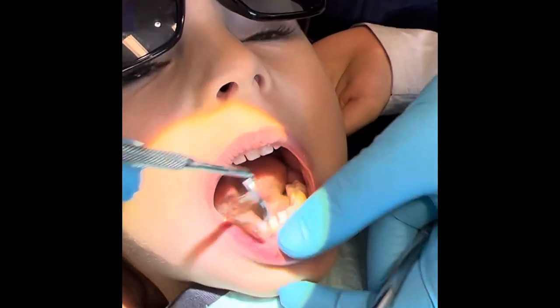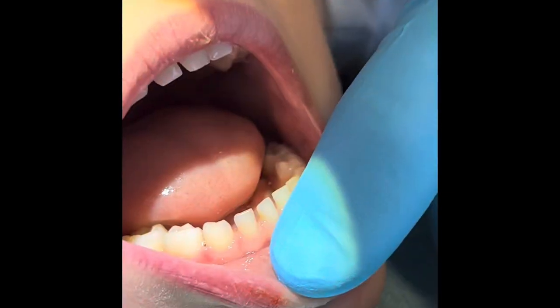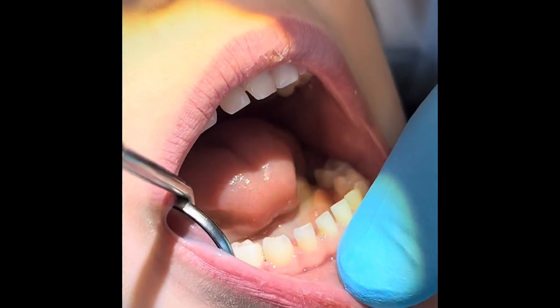How does that feel? Oh good. Open big and we'll show the space here — relax your lip. You don't need a lot of space, just a little bit of room.